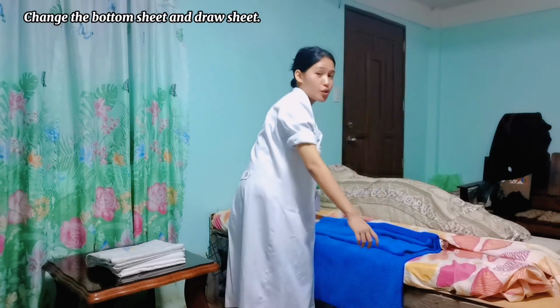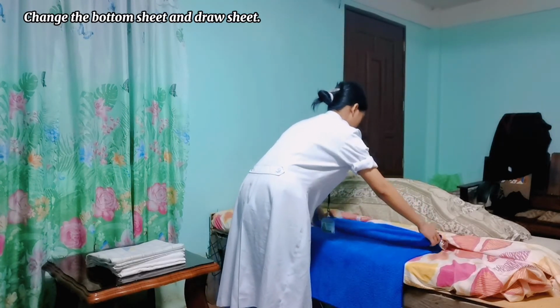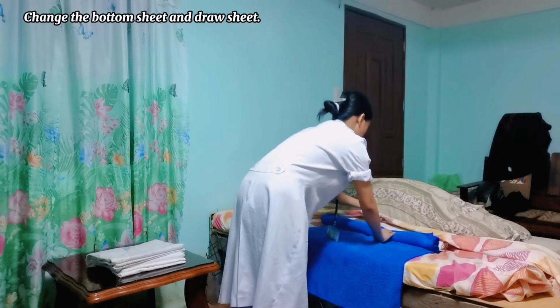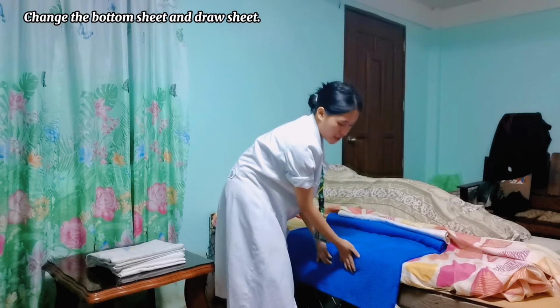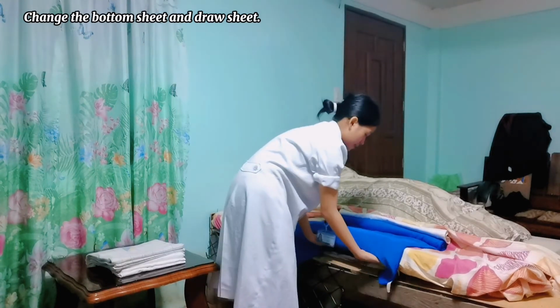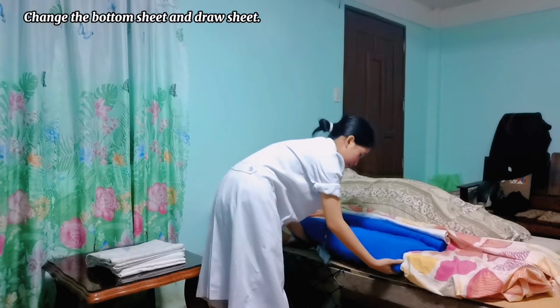We will also unfold it. And then also tuck it in under the mattress, together with the rubber sheet.